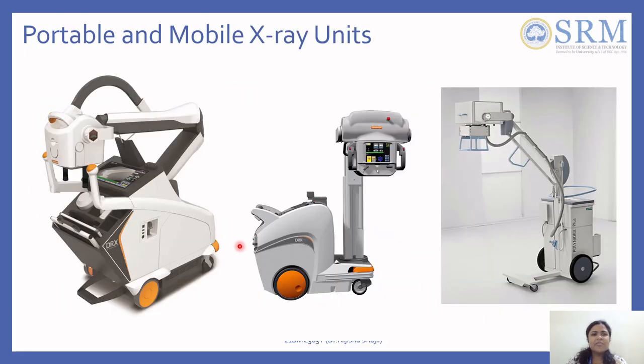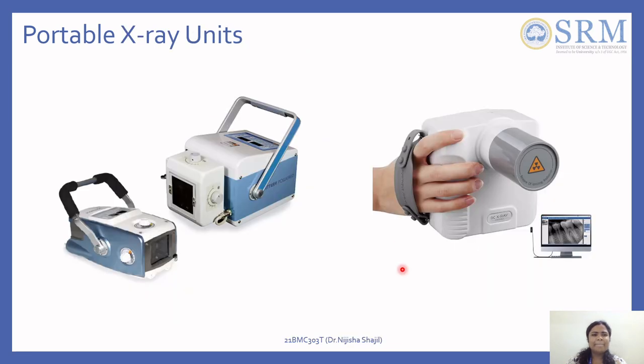So this is an example of your portable and your mobile X-rays. So you have the whole system. So these are all examples of both. So usually they use both of them interchangeably. So these are some examples. You can see everything is in a single unit, the generator, the X-ray tube. Then this is the vertical column. Wherever you want, you can move it and you can image it.